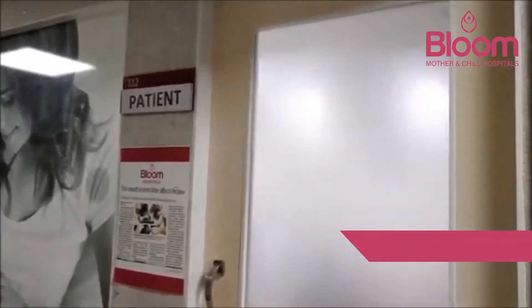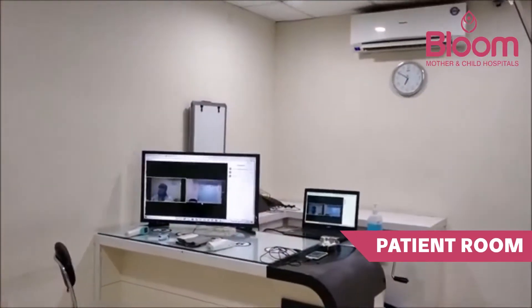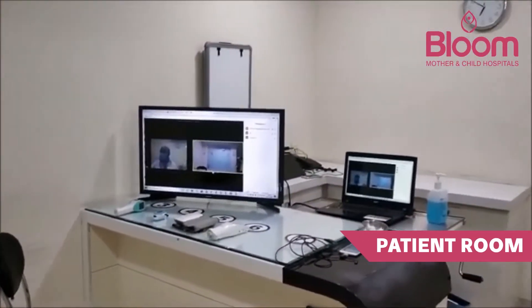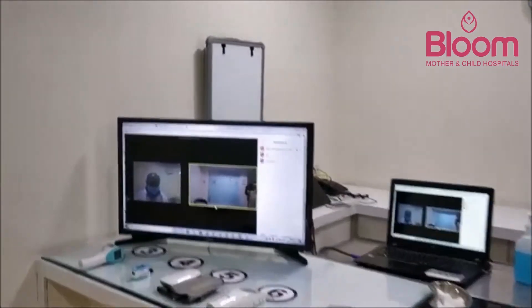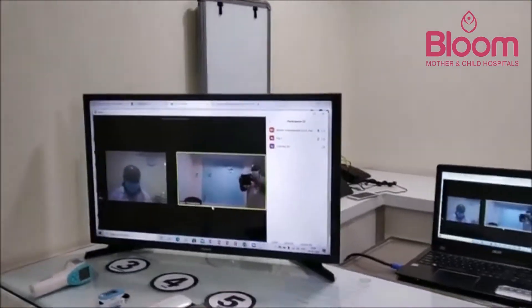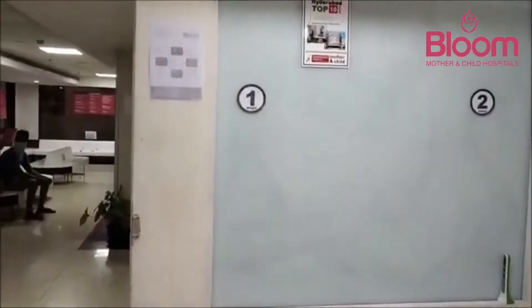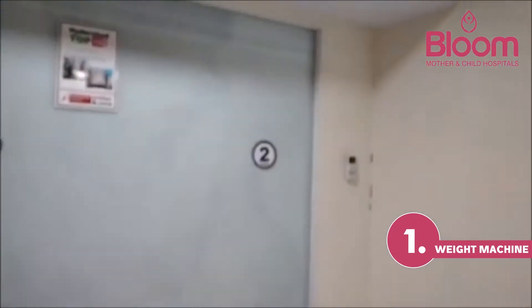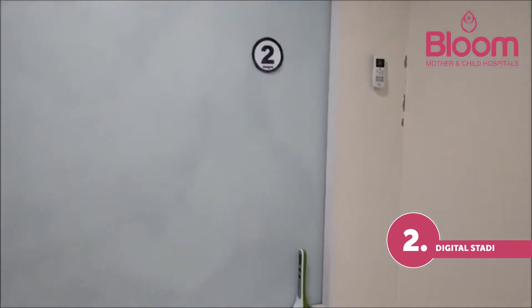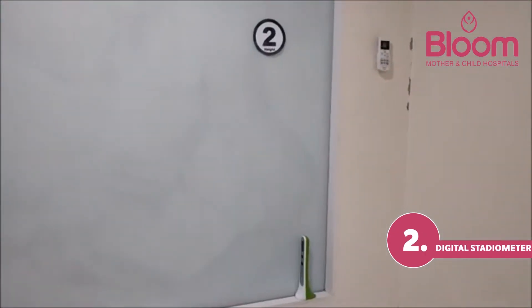We are now in the patient area, connected with devices in a touchless clinic. The doctor is sitting in a different room. Station one is the weighing station, and station two is where patients can measure their height using a digital stadiometer.